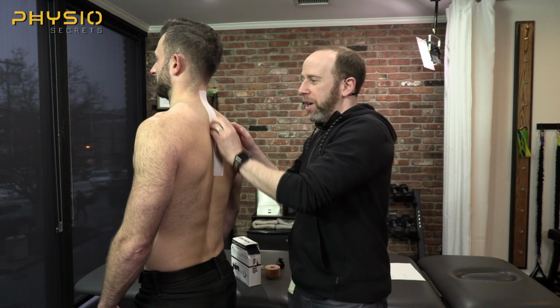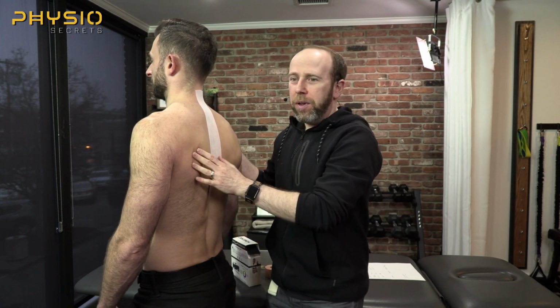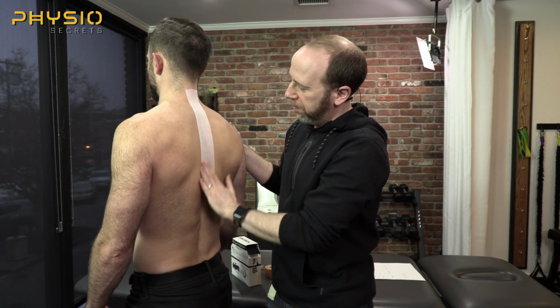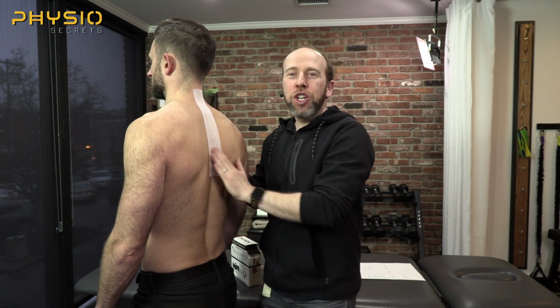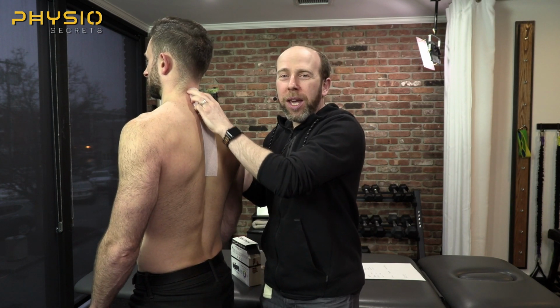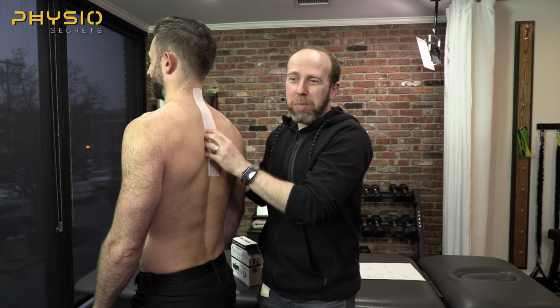Now, the reason that's important is, do you feel the tape right now? Yep. Like, you know you have tape on you, but do you feel it pulling? No, not at all. Not really. Okay, so he's in good posture and the tape is not pulling. That's perfect. So now when he's a good boy, he gets rewarded by no tape pull.